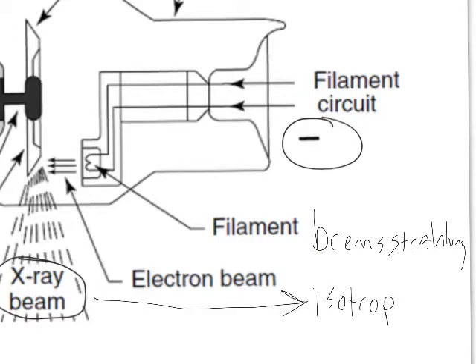The other big fancy word that we talked about here is isotropic. Have y'all got your notes on Brems? Okay. Isotropic means it happens in all directions. Like we have isocenter, right, within the patient. Iso is like a center. I think it means center. I don't remember. Iso, what does iso mean? I don't know. Sorry, I can't remember. Equal center. Okay. So isotropic, I guess tropic like in all directions, equally in all directions. Isotropic, equally in all directions.